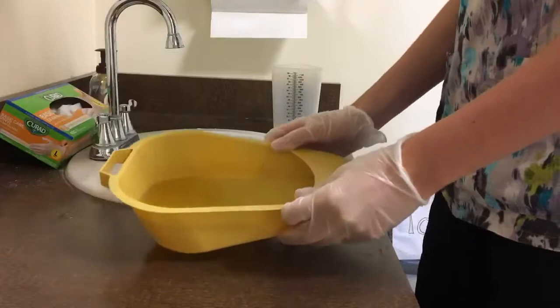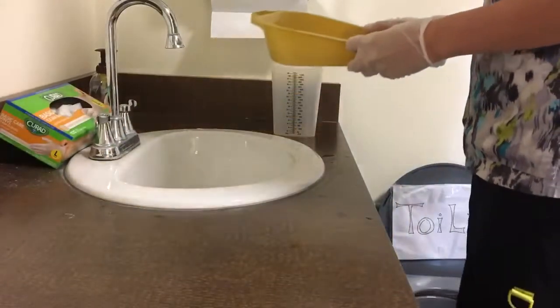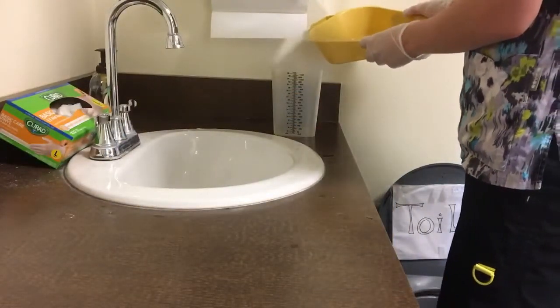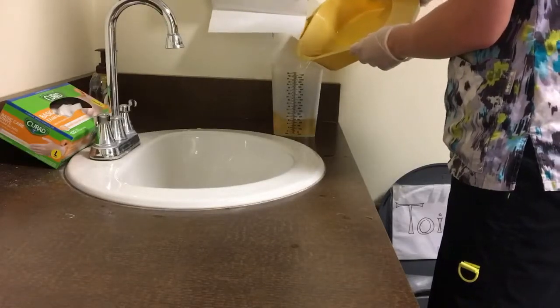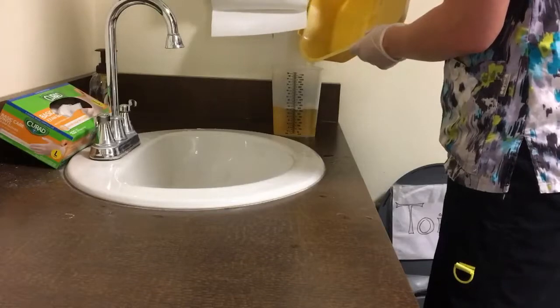Then slowly pour the contents of the bedpan into the graduated cylinder, keeping the graduated cylinder or container on a flat surface at all times.